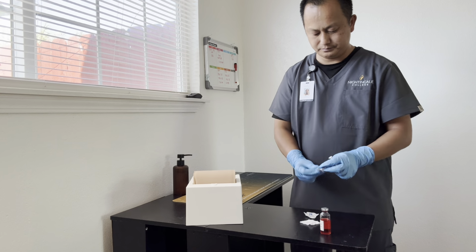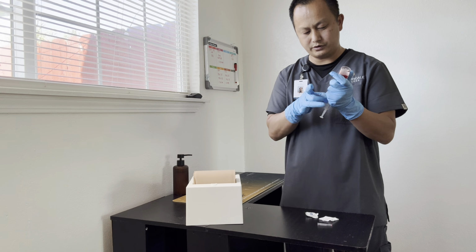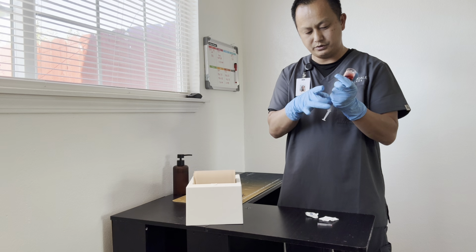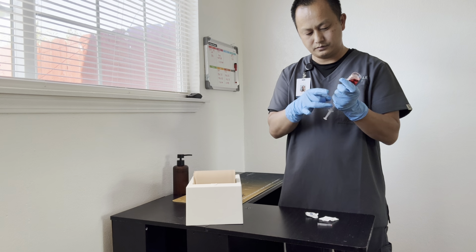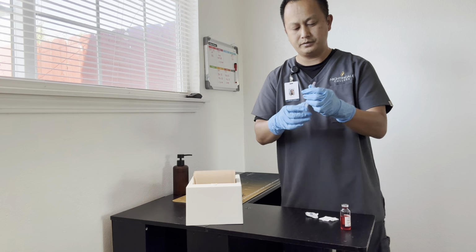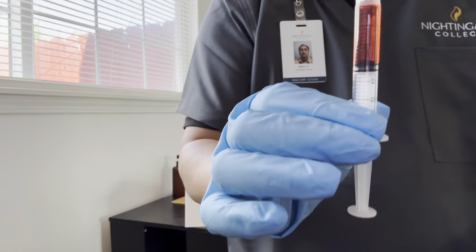Okay, and then invert the vial. We are drawing out 1.5. Okay, and we will flick our syringe to make sure that we get rid of all the air bubbles. Okay, once all the air bubbles are out, we will use our scooping technique to recap our needle. I will show the camera my 1.5.